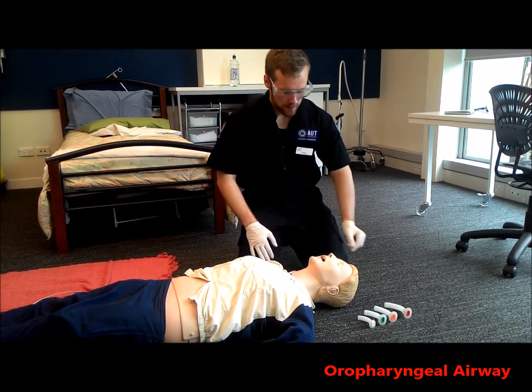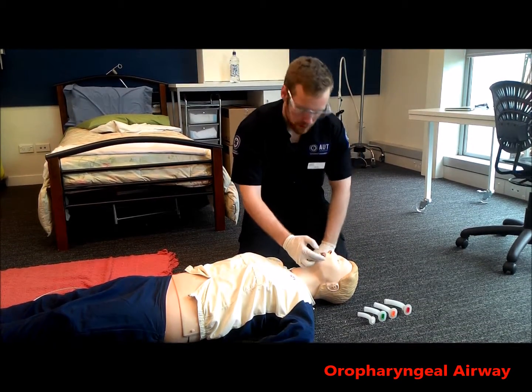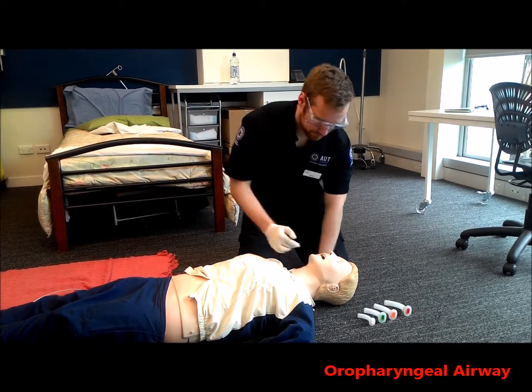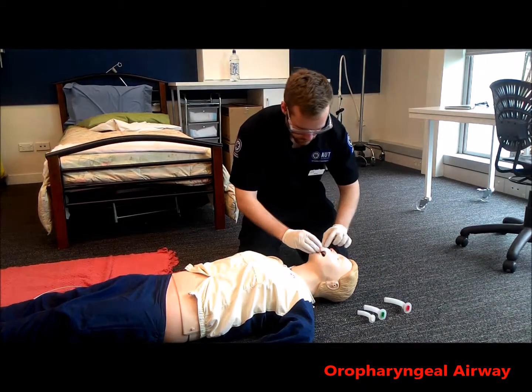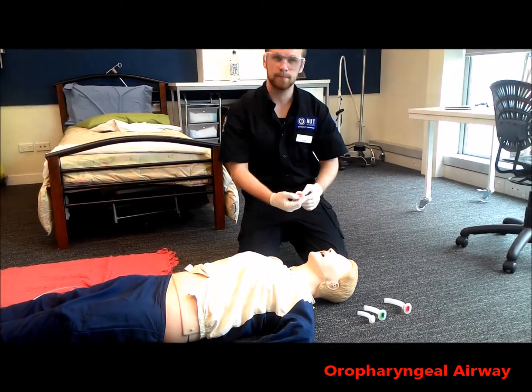Next, we want to measure the OPA. So you do this from the first incisors to the angle of the mandible, or the edge of the mouth to the edge of the ear. From the first incisors to the angle of the mandible. So this patient is a 3.